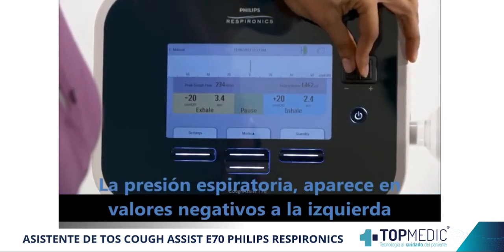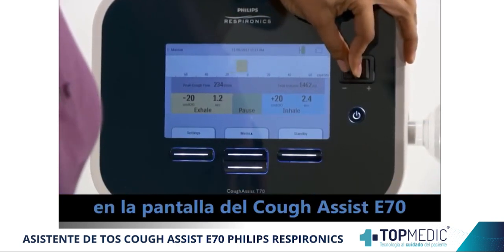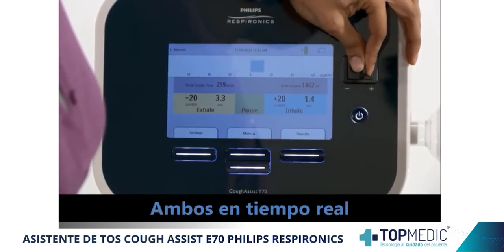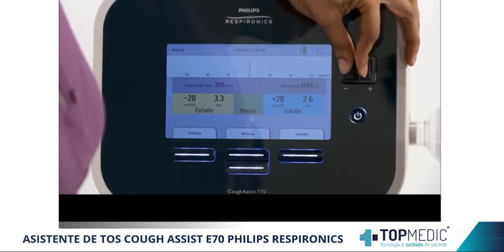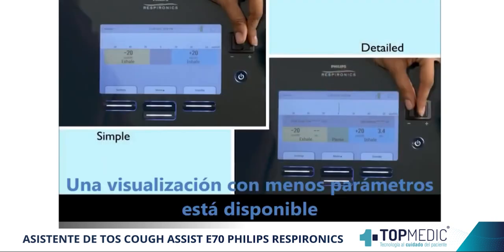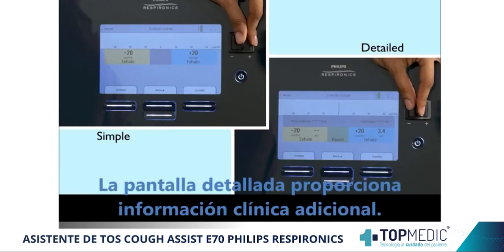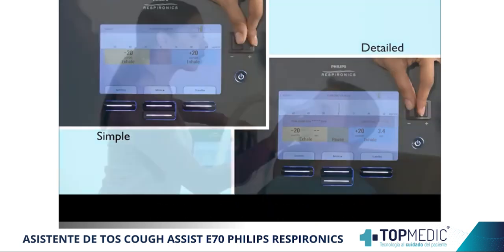Exhalation pressures appear on the left as negative numbers on the Cough Assist T70 screen. Inhalations are shown as positive. Both appear in real time. A simple screen view with less respiratory information is also available through menu options. The detailed screen provides additional clinical information.